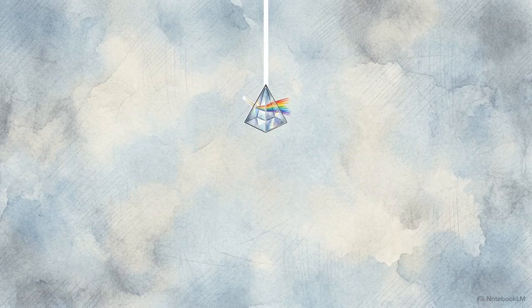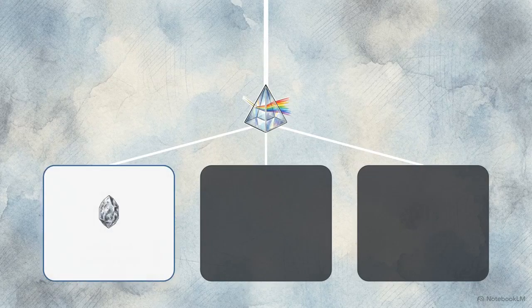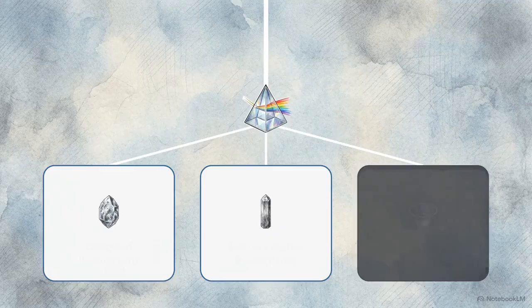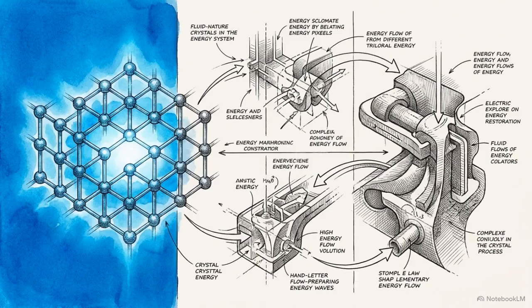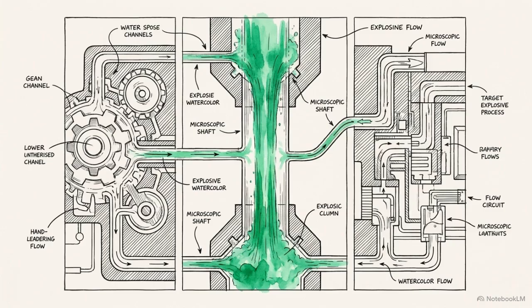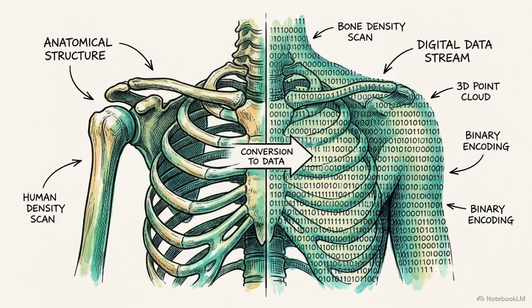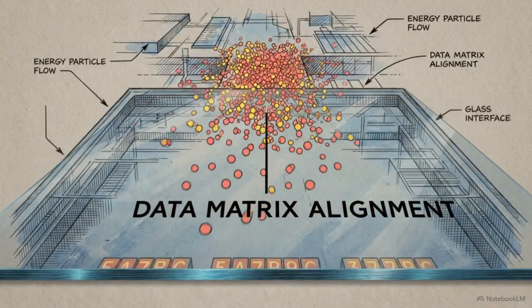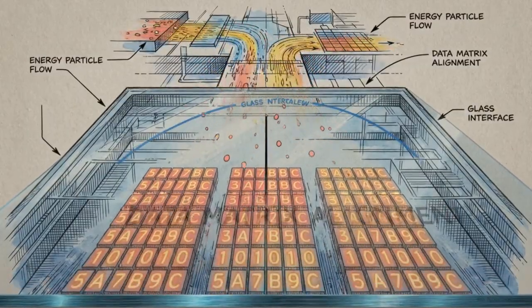To trap and translate radiation, modern clinical engineering relies on three distinct hardware architectures: computed radiography, indirect digital radiography, and direct digital radiography. Each employs a different mechanism of action. Computed radiography uses delayed light emission. Indirect DR uses instantaneous light emission. Direct DR generates electrical charge carriers. By analyzing the solid-state physics governing each of these pathways, we can map exactly how anatomical density is converted into data.